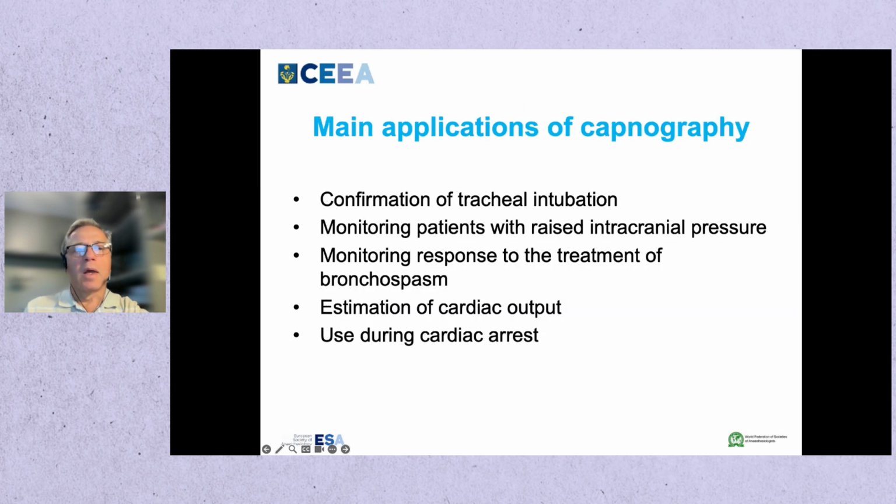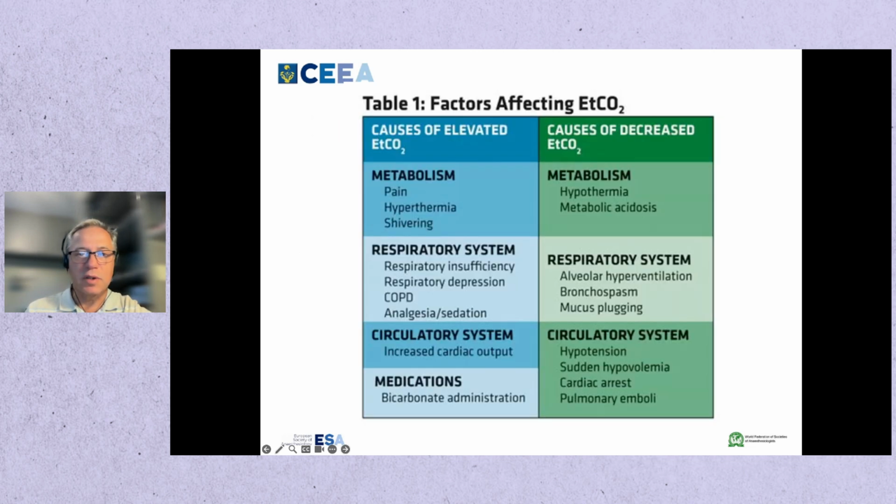Okay. What are the applications of capnography? There are many: confirmation of tracheal intubation, monitoring patients with raised intracranial pressure, monitoring response to the treatment of bronchospasm, estimating cardiac output, and use during cardiac arrest. And particularly for cardiac arrest, the confirmation of the tube being inside is important. Monitoring ventilation rate during CPR and avoiding hyperventilation, assessing adequacy of chest compression during CPR, identifying return of spontaneous circulation, and it can also be used for prognostication during CPR.